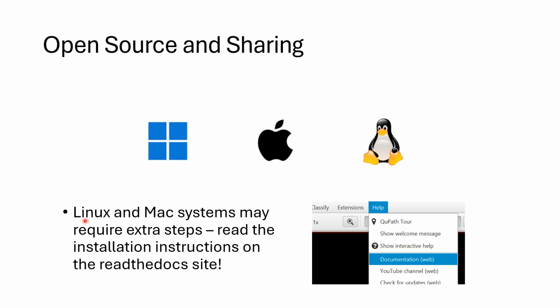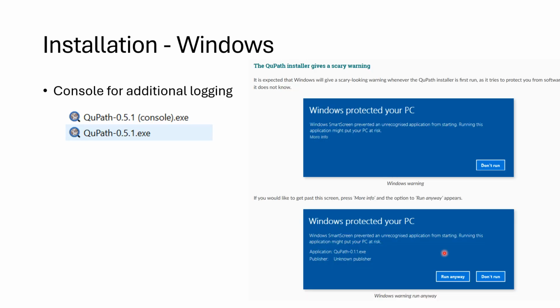That's all well and good, but the Linux and Mac systems may require a few extra steps, so please read the installation instructions. I'll go over a little bit of information here, but mostly go for the Read the Docs instructions. And once you have QuPath installed, you can always go to the help documentation, which will take you to that Read the Docs site.